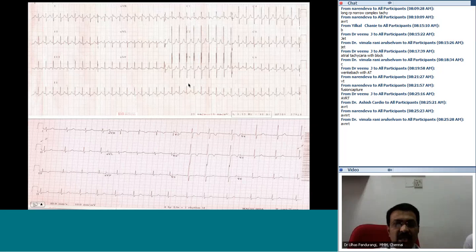But among atrial tachycardia, AVRTs, PJRTs and JET, AVNRT is the least common tachyarrhythmia in the pediatric age group.